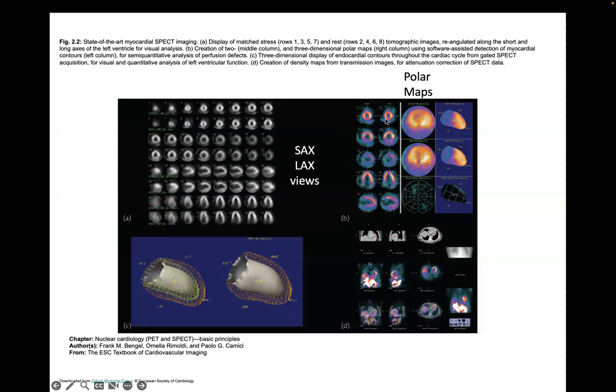If you look at these maps here, they're colorized sometimes just to increase the visibility of abnormalities. But all the color corresponds to is a single scalar value that either goes up or down. Here, the bright white to orange means there's high perfusion, and this purple means there's low perfusion. And so the asymmetry of the perfusion map here is an indication that there is low blood flow in this part of the heart. And this is done millions of times a year. Cardiac SPECT scans are done for people who have suspected abnormalities in their blood flow to their heart.